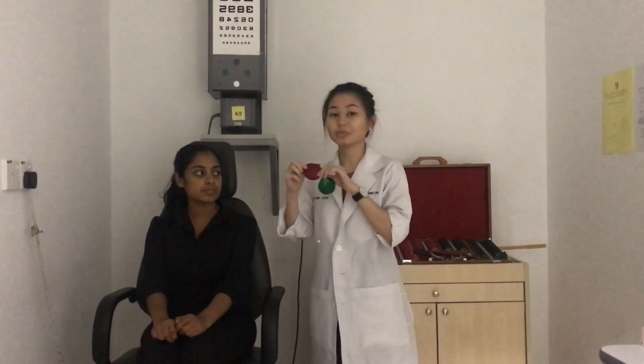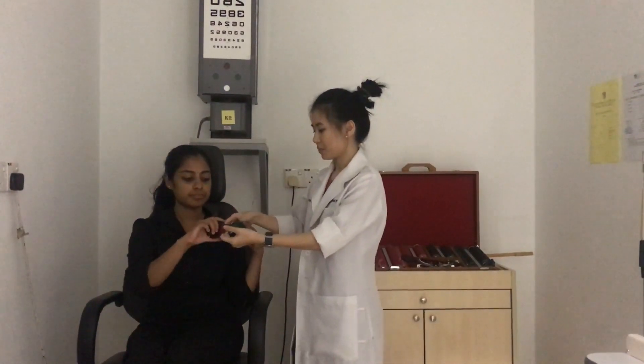Hi, I'm Patrin. I'm going to demonstrate the central suppression scotoma test. This test can only be done if the patient has normal flat fusion. First, make sure the room is dim. The patient needs to wear their refractive correction, then wear the red-green goggles over the correction — make sure the red filter is placed on the right eye and the green filter is placed on the left eye.